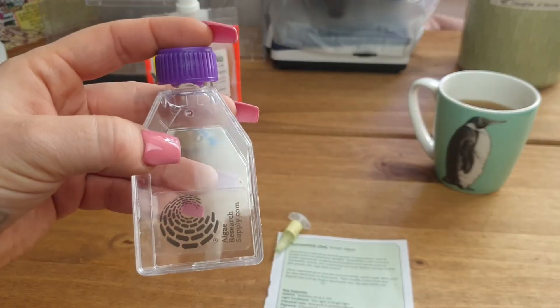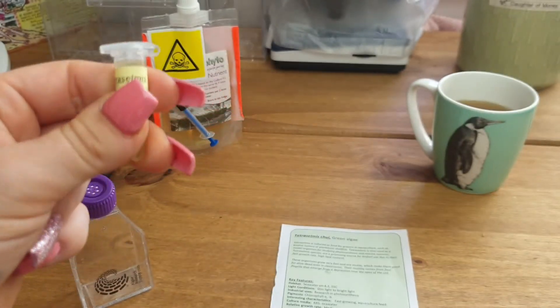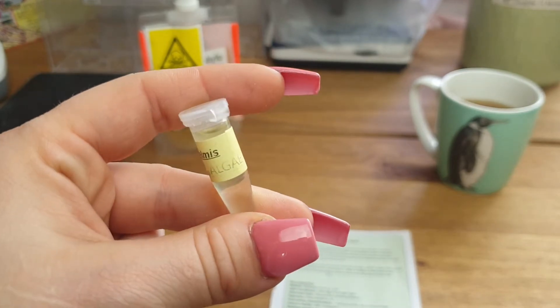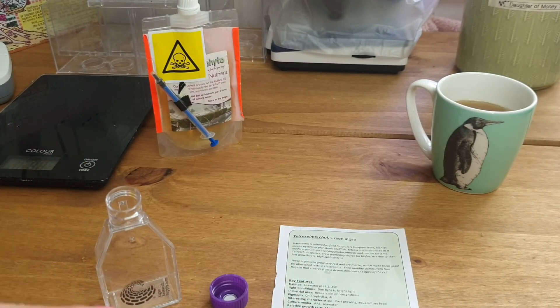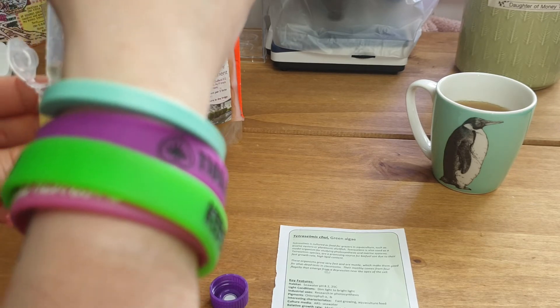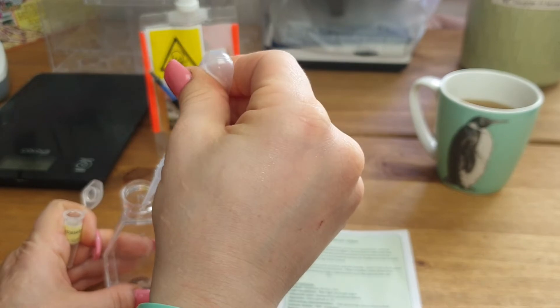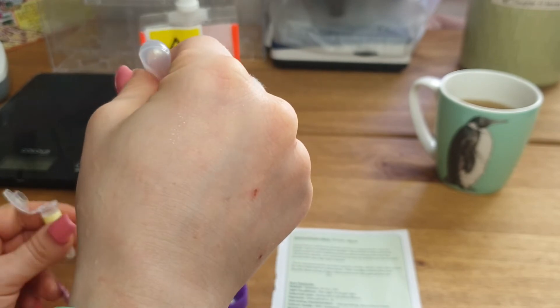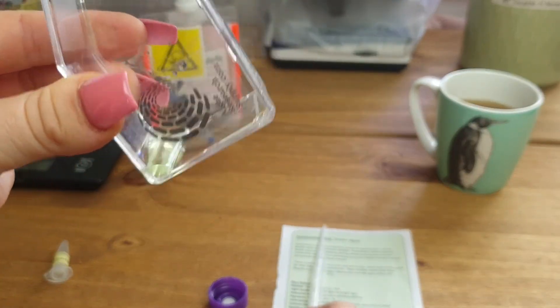This is my culture flask from Algae Research Supply in the US, which is where I got my culture from. Today we're going to be culturing Tetraselmis. What I'm going to do is open the culture flask and just take a pipette to get all of the algae in. In my last video I just shook it out, however that can actually harm the algae and the bacteria in there, so it's best to do it this way. That's all out — the flask is empty and you can see the algae is in the bottom.